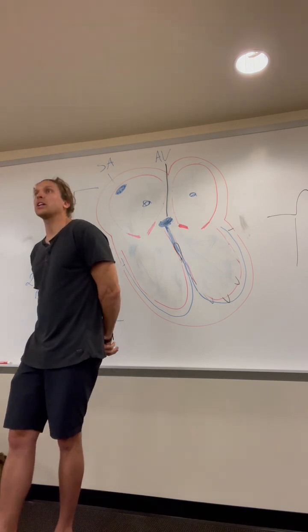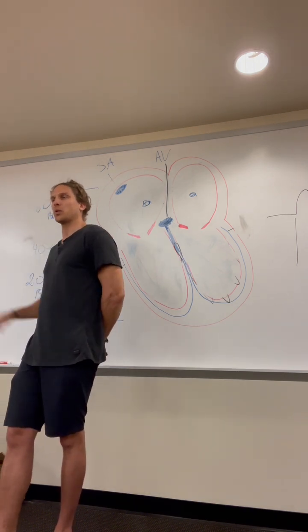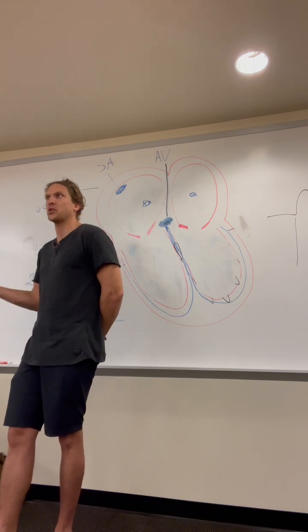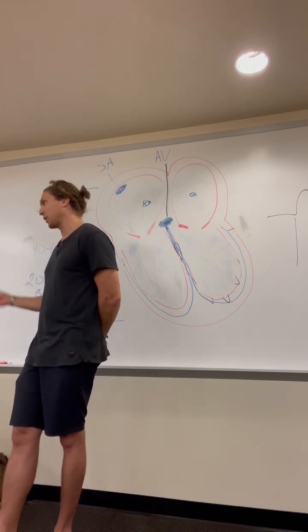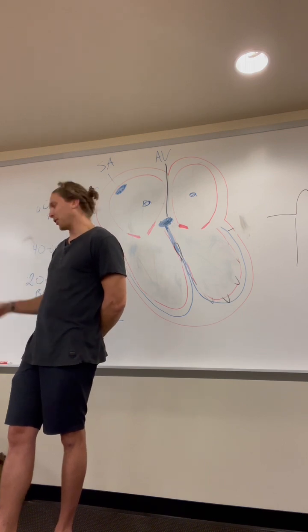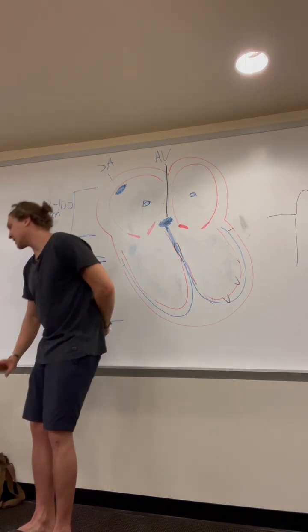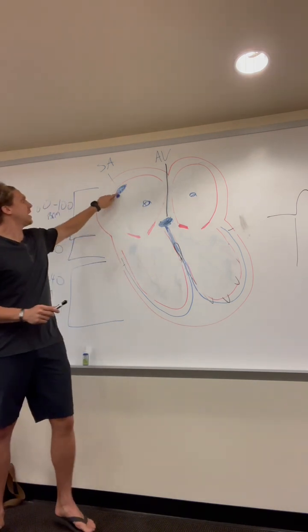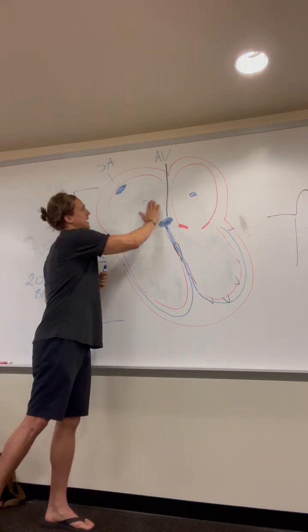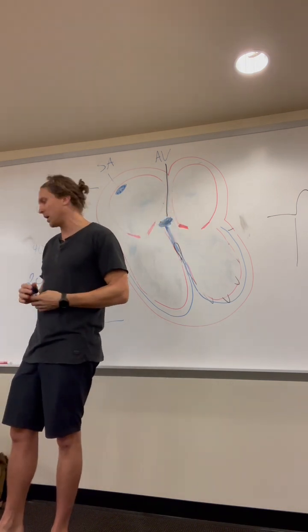When you see bradycardia, start thinking AV blocks. Those are a slower heartbeat because we're dropping some QRSs, so there are fewer QRSs per minute, so they're probably going to have bradycardia, especially with your 2nd degree, 3rd degree. And then sinus tachycardia. All 3 I went over are initiated at the SA node. It's just whether it's too fast or too slow, which makes it a dysrhythmia.